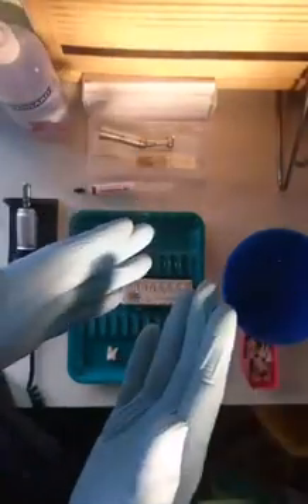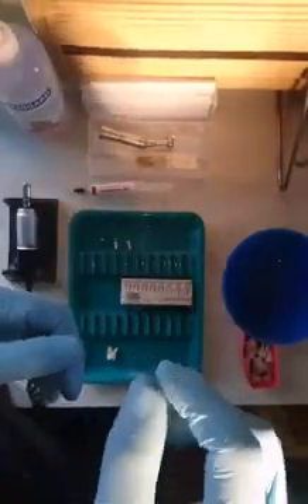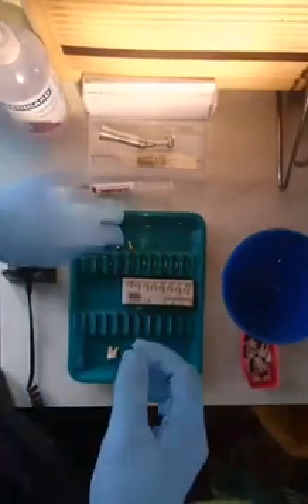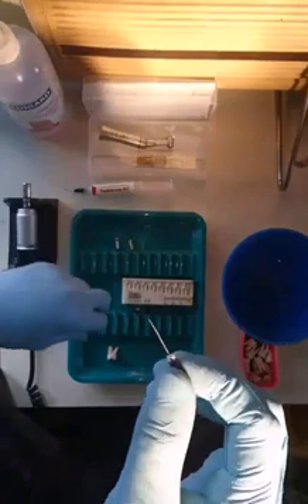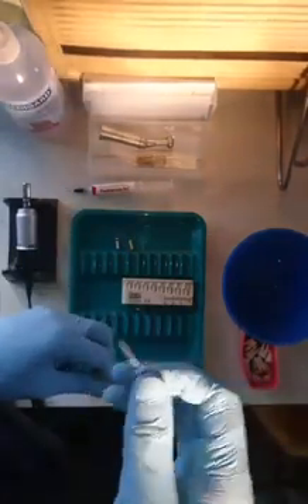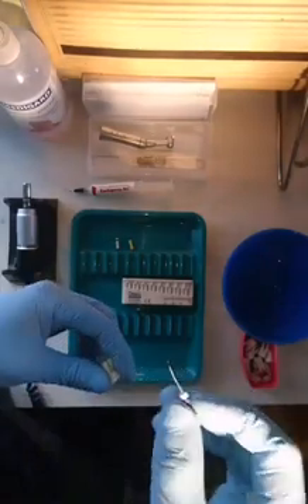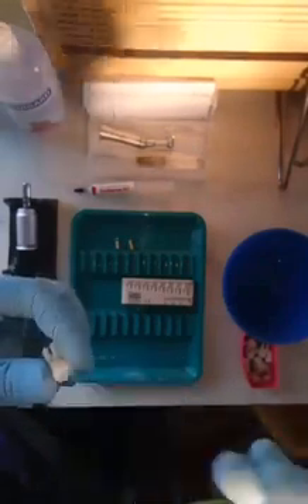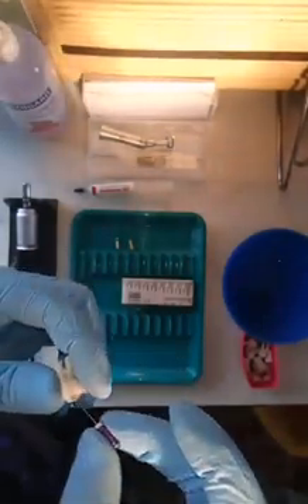So the idea is to have an access prepared. Coronal flaring has been given for an easy straight path access, and later on we have to enter the canals using a size 10 reamer or a file — preferably a reamer because of its flexibility, so it can easily slide past all those nicks and curves inside those canals.